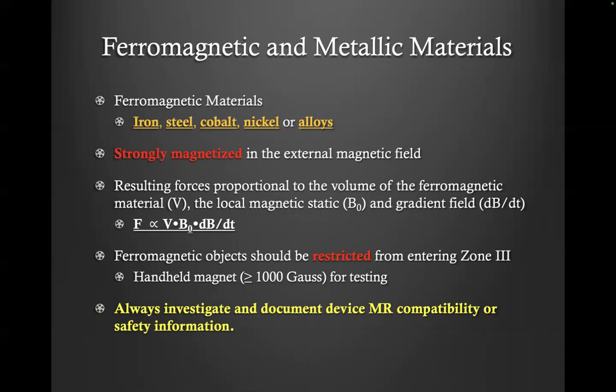The reason I put the equation here is just to know that the larger the item is, the larger the force is going to be. It's going to fly to the MRI, and sometimes you will not be able to remove it. If it's really an oxygen cylinder being stuck, human force will not be able to unstick it. You can only ramp down the magnet and make it no field to remove it.